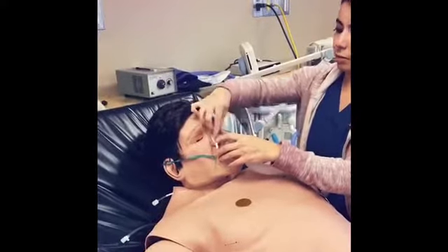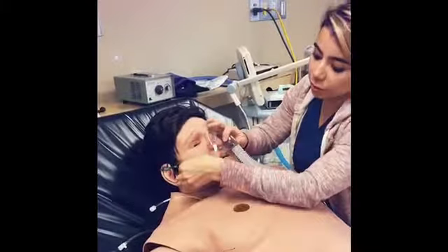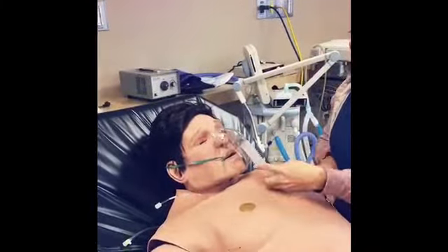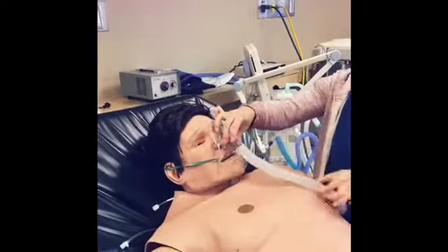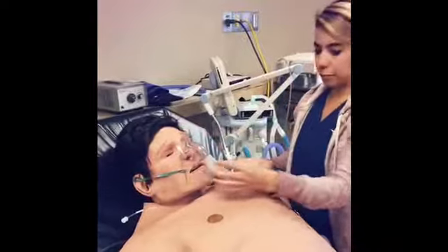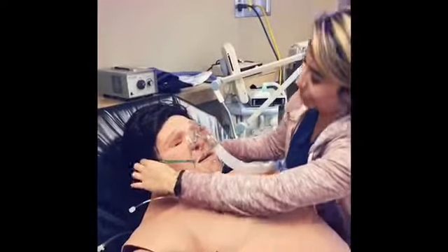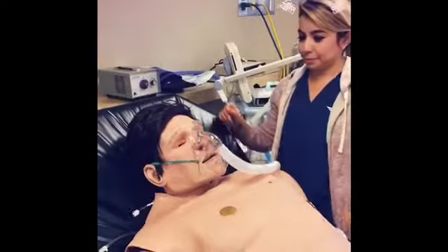An adjustable elastic strap that fits over the patient's head holds the mask in place. A piece of tubing connects the mask to the oxygen source. Extension tubing is usually added to allow the patient more freedom in movement. Patients may feel claustrophobic, and its usage may interfere with feedings.